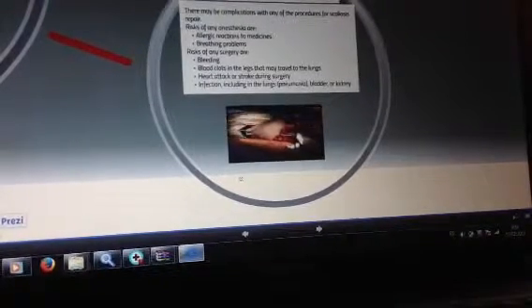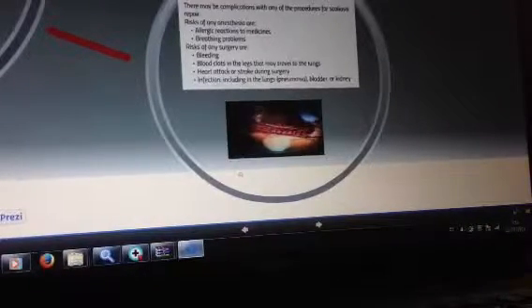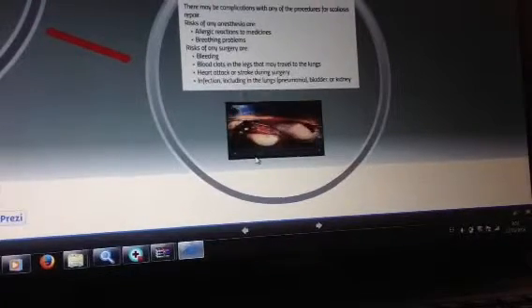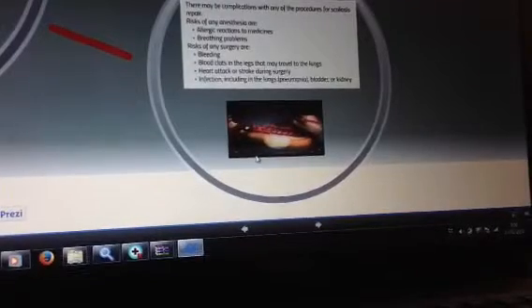With the rod and the proximal screws, I'm able to cantilever the rod distally into the lower screws of the construct. And we place the rod in the coronal plane, taking advantage of the sagittal bends to make it easier to insert. And we'll use the old-fashioned hook holders to pull the spine to the rod.